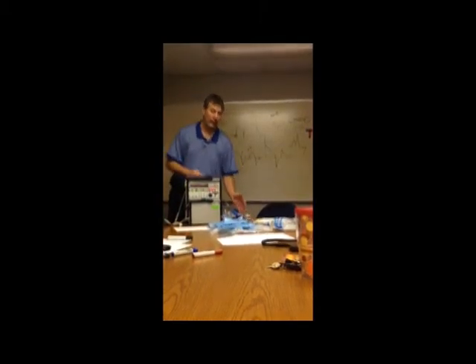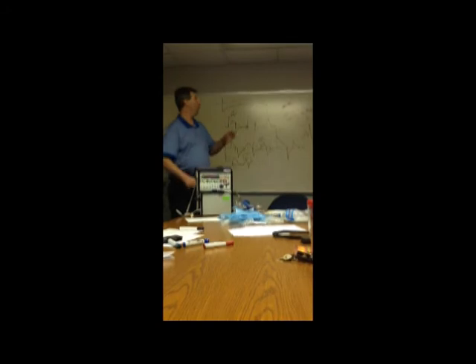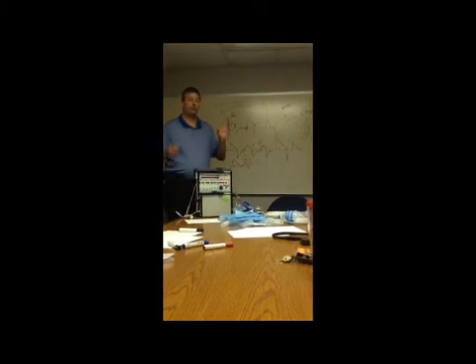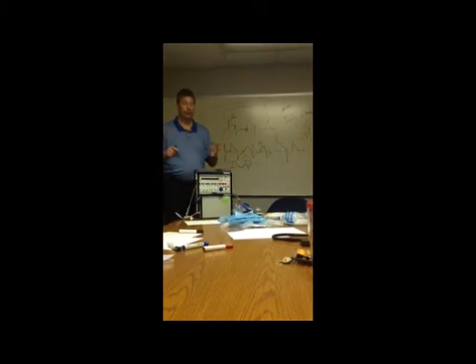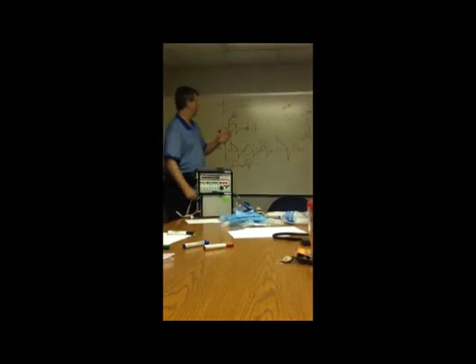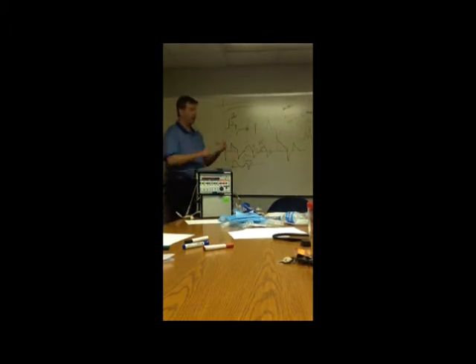It really is not an increase in their lung pressure. But anyway, all right, so now, next thing we need to talk about before we get out of here is breath types. So far, we've gone over 3 modes of ventilation, right? Assist control, IMV, or SIMV, and CPAP PSV. What makes 5 modes that we use?